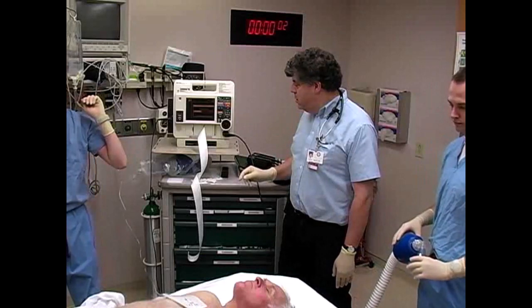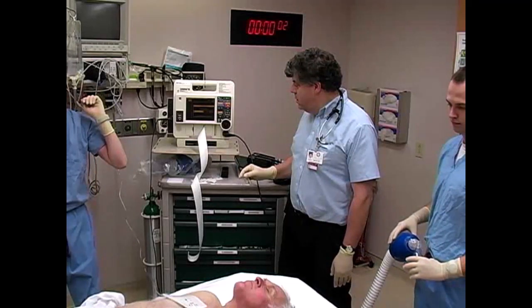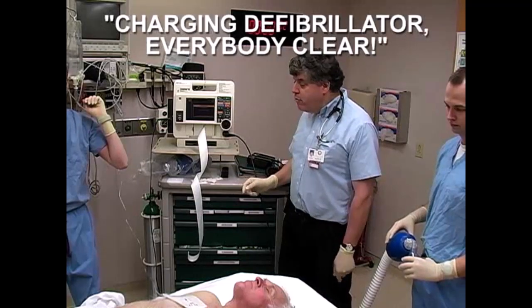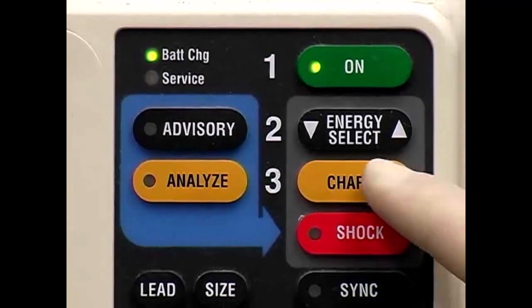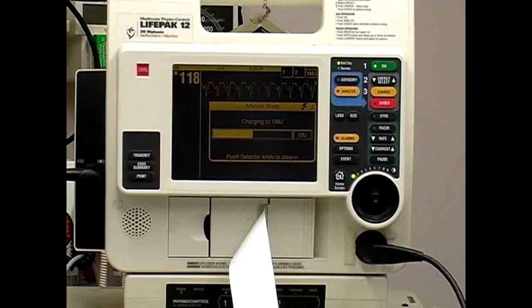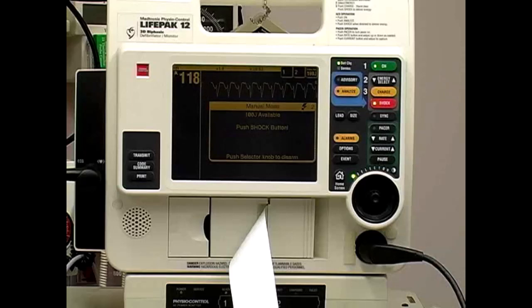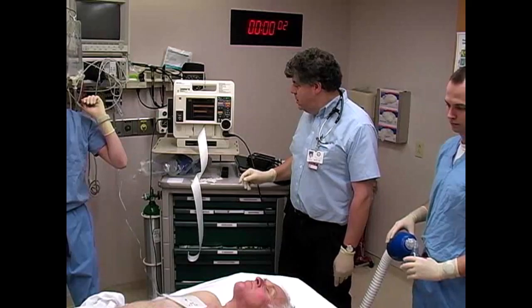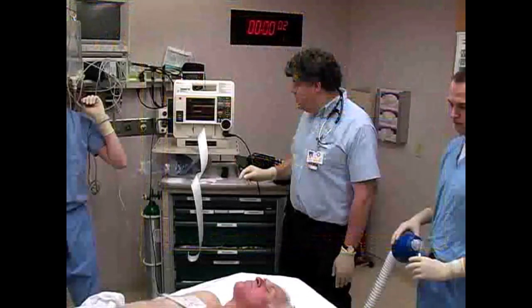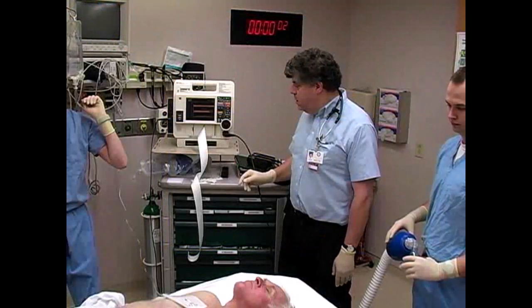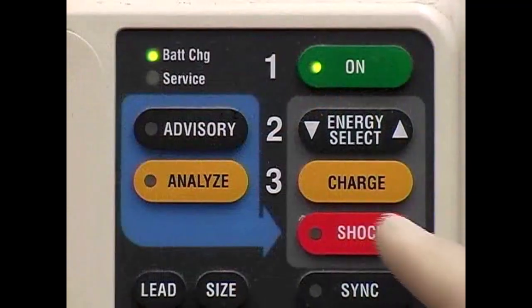Before charging the machine, it is essential to ensure that no caregivers are in direct contact with the patient to avoid being shocked themselves. Firmly announce, "Charging defibrillator, everybody clear?" Once everyone has stepped back from the patient, press the Charge button and the defibrillator will charge to the selected energy. Once charging is complete, confirm that you are not in contact with the patient and firmly announce, "I'm clear." Check that the other members of the resuscitation team are not touching the patient or stretcher and announce, "Everyone is clear?" Then depress the Shock button.